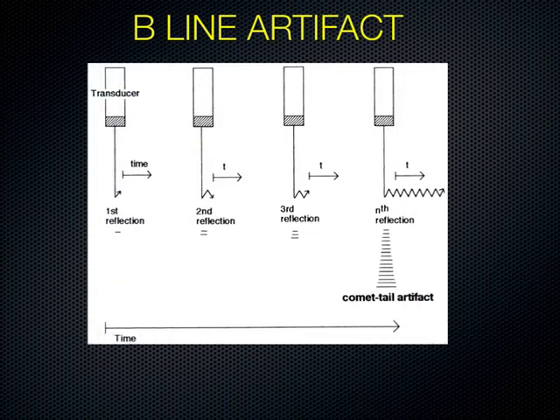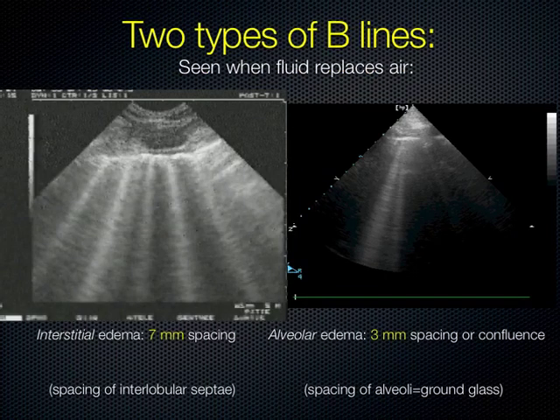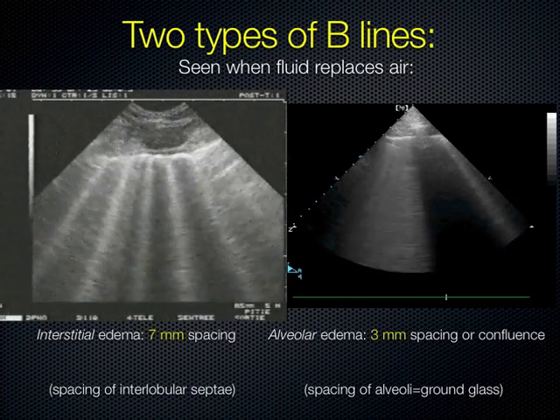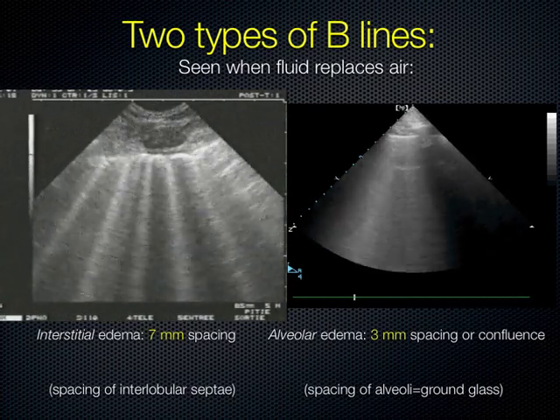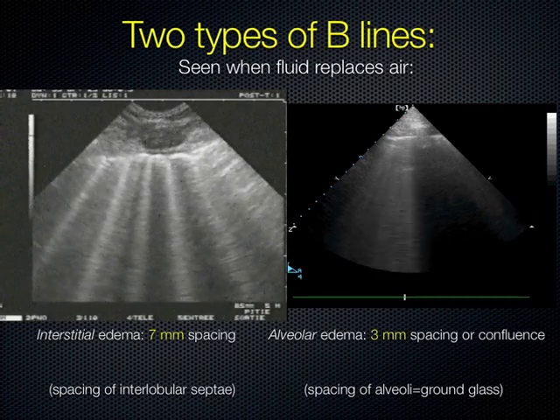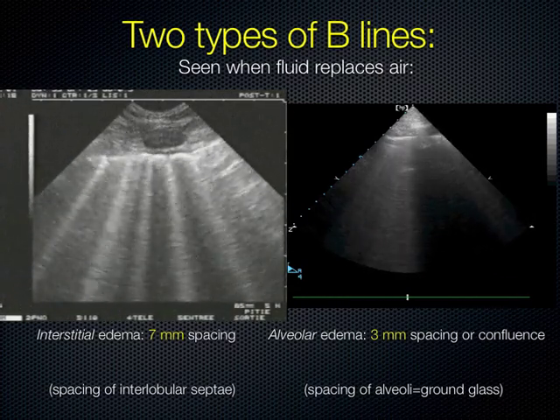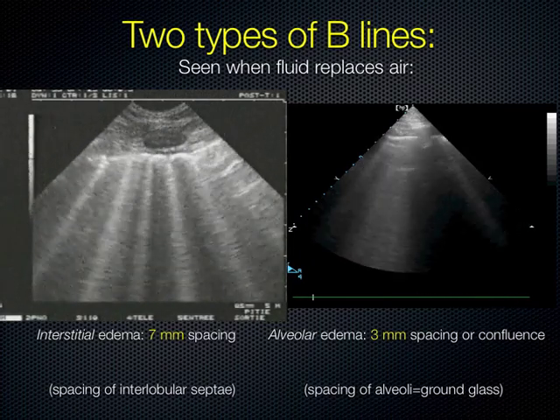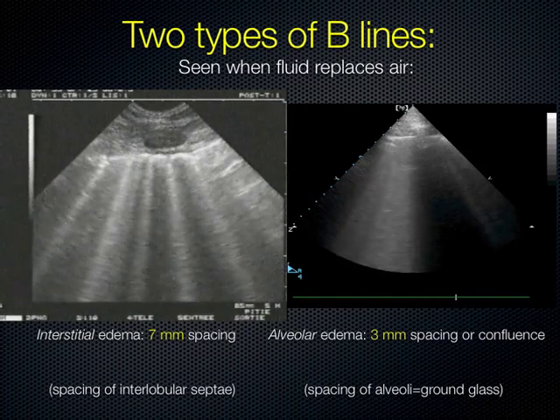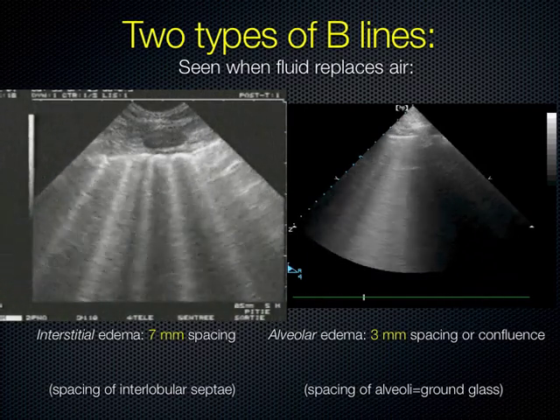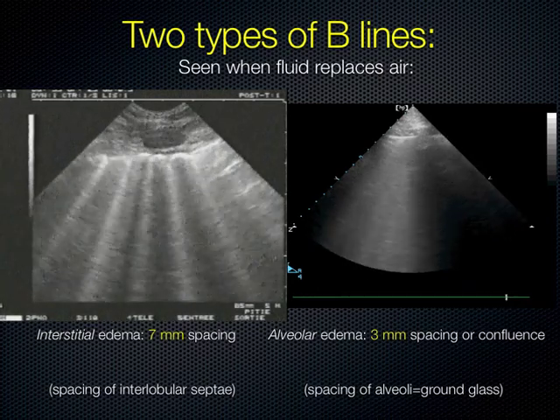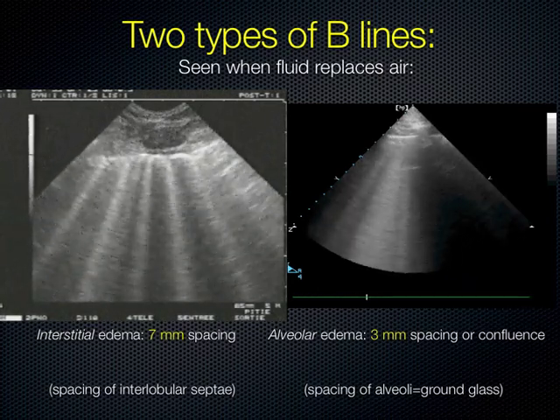You'll see two different types of B lines. The more gross appearance on the left is interstitial edema — fluid in the interlobular septae but maybe not in the alveoli yet — and those tend to be spaced about seven millimeters apart at the chest wall. The finer, more diffuse appearance on the right is when you progress from interstitial edema into alveolar edema, or ground glass, where the fluid is actually in the alveoli — spaced only about three millimeters apart, giving a diffuse B line pattern.